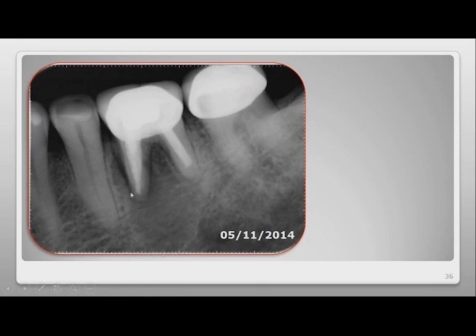The periodontium in the neighboring teeth was seen clinically as well as via X-ray. Here we can see perfectly that it is intact. The lesion is apical, extending almost 10 millimeters from the apex of this root to the end of the lesion.